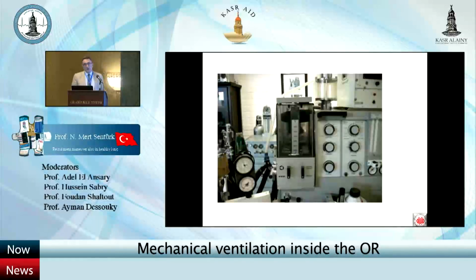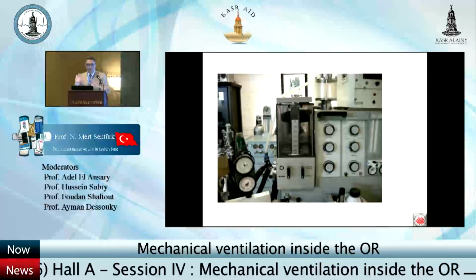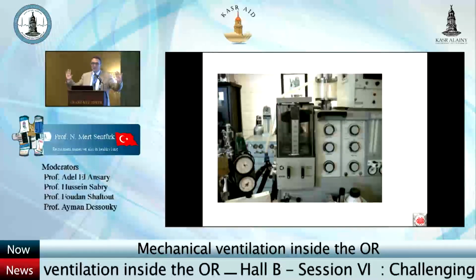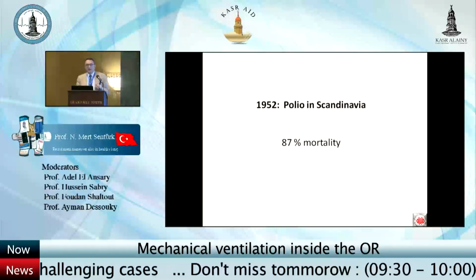I asked my teachers, what is this knob good for? They said, okay, this is a sigh knob, but this is now historical. We don't use it anymore. Forget about it. Sigh is now very dangerous during mechanical ventilation. It was 1990. It's okay. How about the mechanical ventilation?